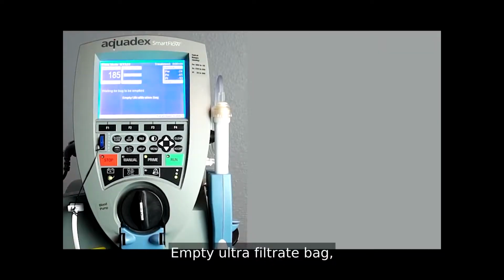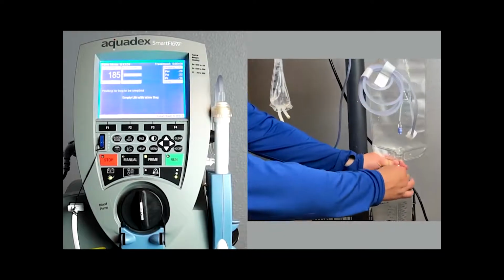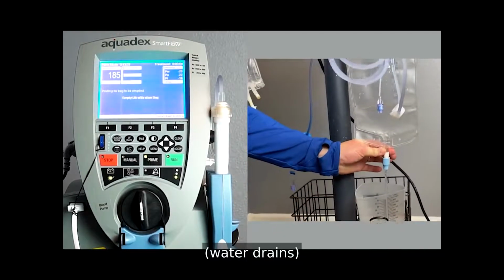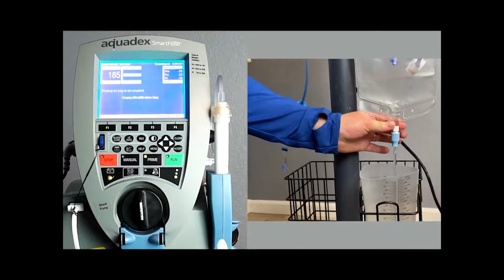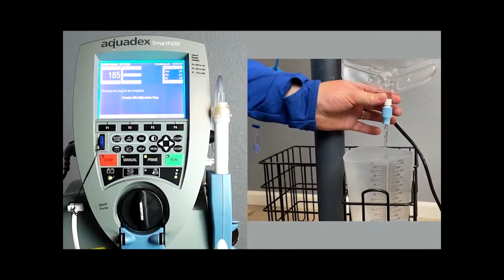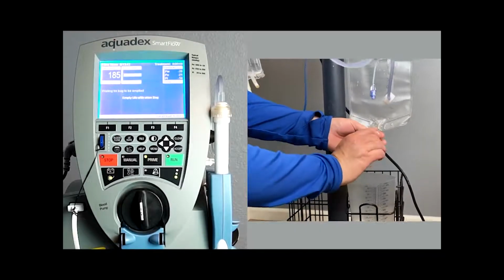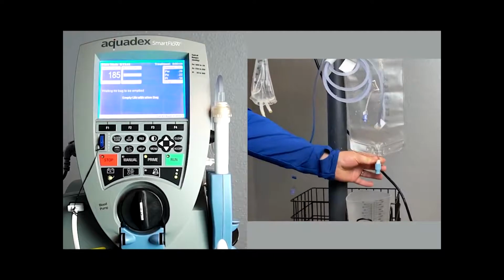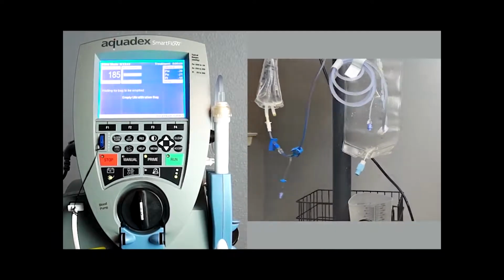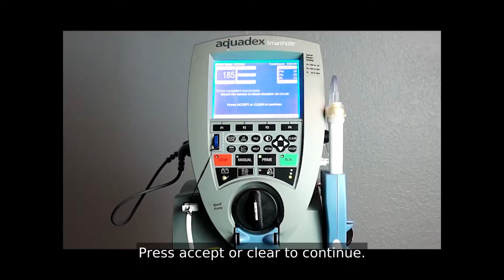Empty ultrafiltrate bag. Close drain. Press accept or clear to continue.